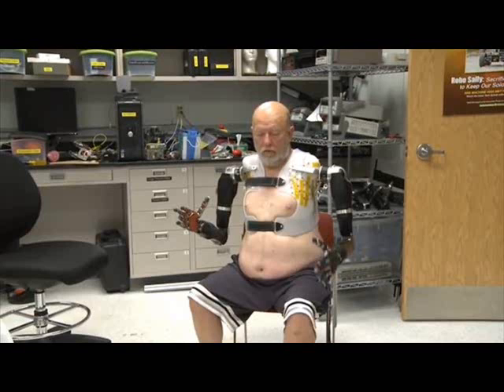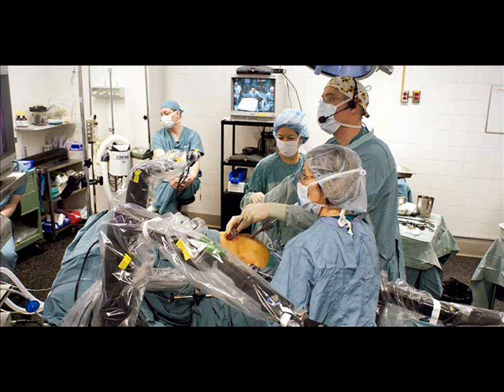Orthopedics. The Robodoc system was released in 1992 by Integrated Surgical Systems Incorporated, which merged into Curexo Technology Corporation. Also, the Acrobot Company Limited developed the Acrobot Sculptor, a robot that constrained a bone-cutting tool to a predefined volume. The Acrobot Sculptor was sold to Stanmore Implants in August 2010. Stanmore received FDA clearance in February 2013 for U.S. surgeries but sold the Sculptor to Mako Surgical in June 2013 to resolve a patent infringement lawsuit.